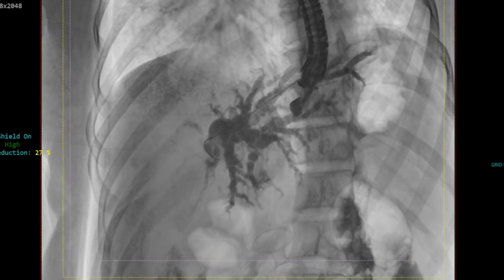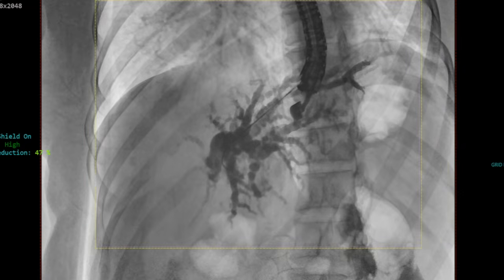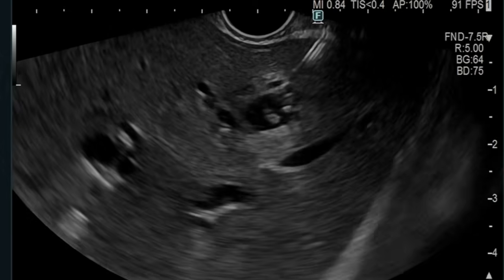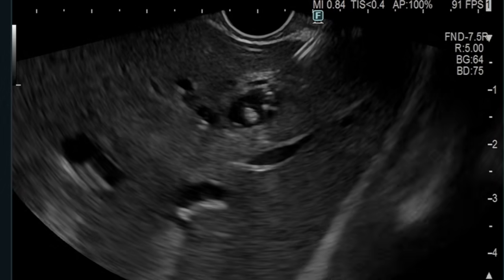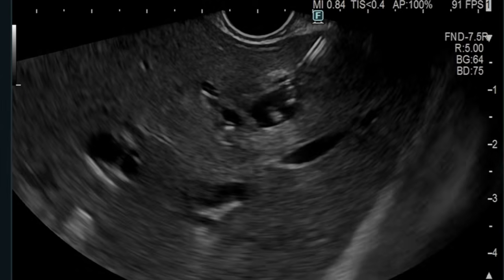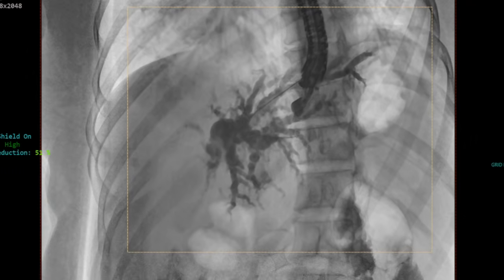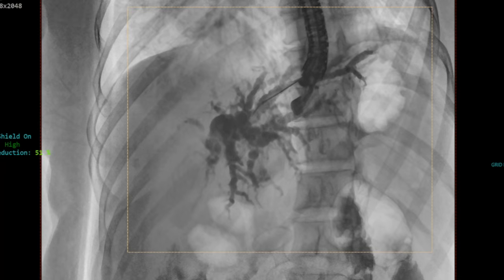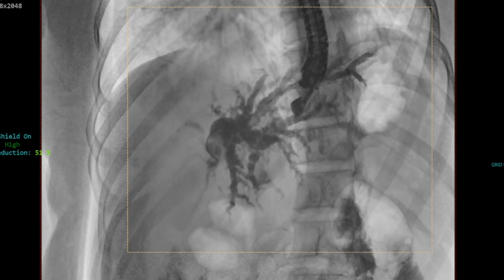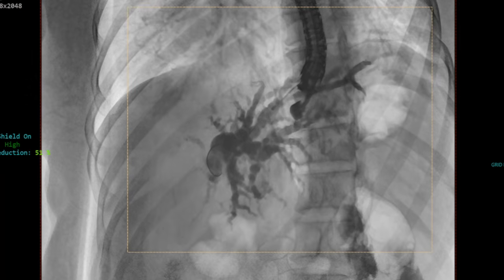A 6 French cystotome is then inserted over the guide wire. It is important to maintain the plane of the transgastric access. The guide wire should be visible on sonographic view at all times. If needed, an assistant should be encouraged to brace the scope at the mouth guard so that the wire is constantly visualized. The wire should be locked in the elevator at exchange and then gently lowered to enable cystotome-induced transgastric puncture via cautery at the same setting as the Axios stent.